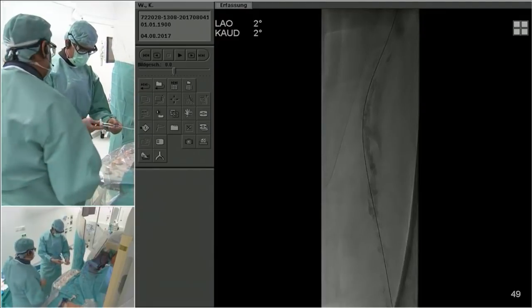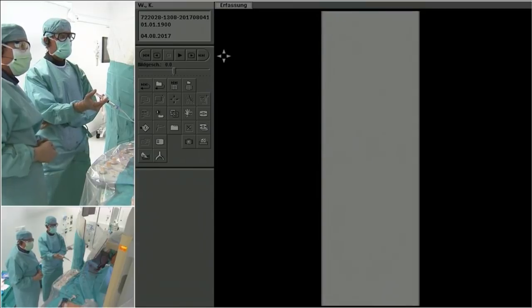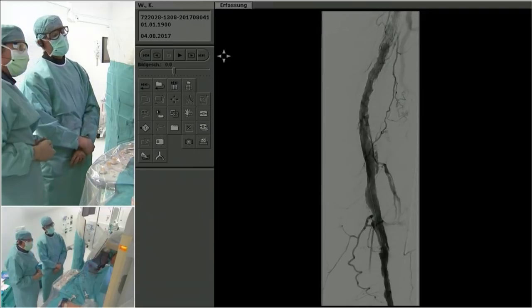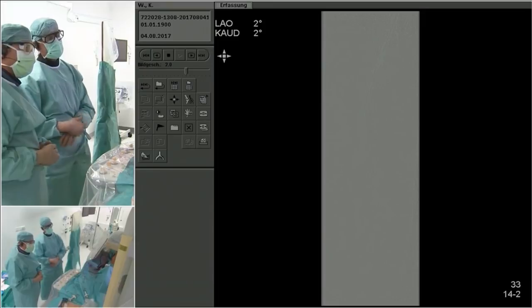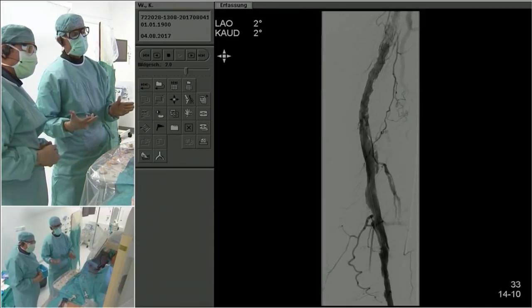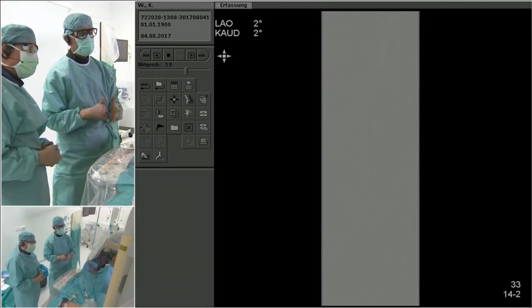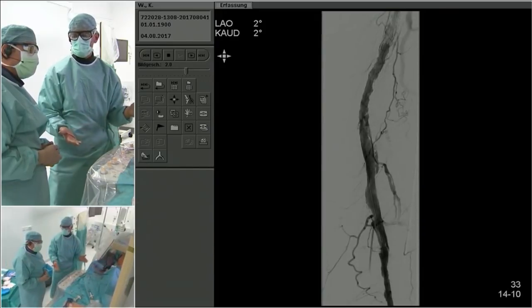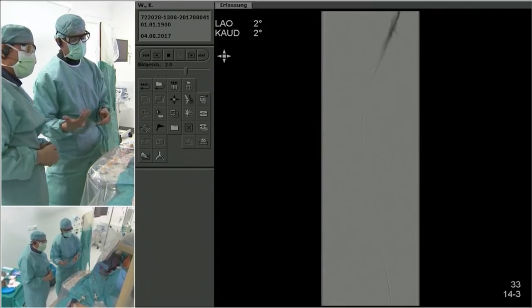Yeah, I heard the concerns about collaterals. Clearly, this is also our concern, that the patient may get worse if reocclusion occurs. So therefore, this is also something where we think twice: shall we take a Viabond in or not? And we actually reserve these Viabonds only for the very extreme areas, and usually the Supera or any other stent extends distal and proximal out of the Viabond. Yeah, what do you think?